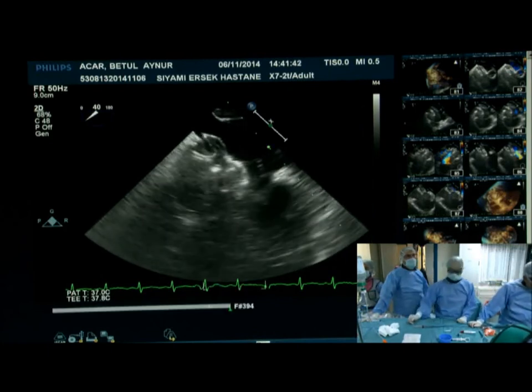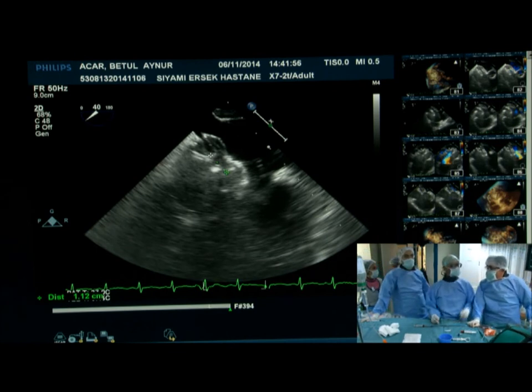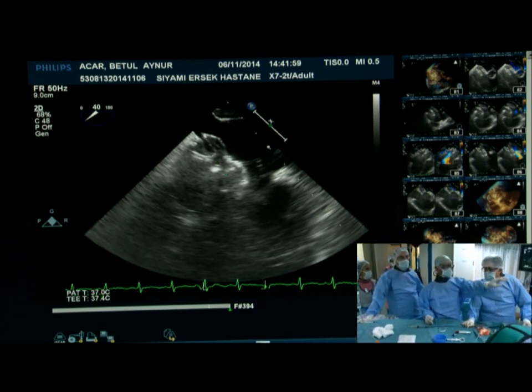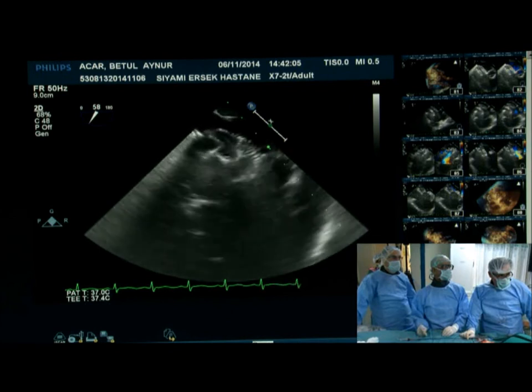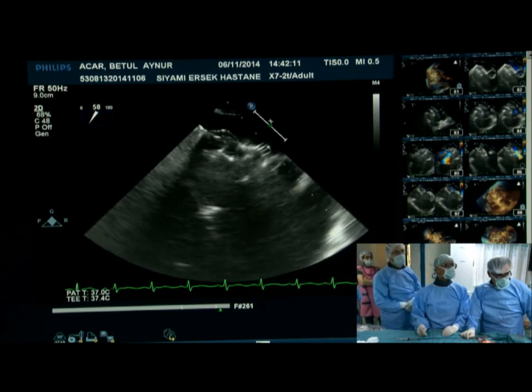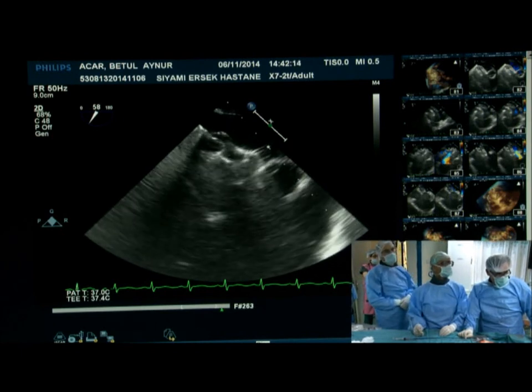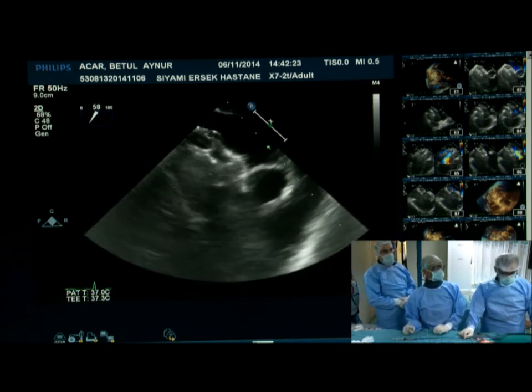Look, Levent, I agree with you. I tend to measure the waist, but the problem arises in terms of imaging, getting the waist on echo as well as fluoro, calibration and so on. So, yeah, but it's not the best image. You can't see. Fluoro is better, Shak. Please turn to the 80 or 90 left oblique. You will see a very good waist, and you can measure that. I generally use the sizing balloon, putting it in front of the patient, then measuring, and I'm checking whether I put in the correct device or not. On the fluoro, LAO 70, let's see.